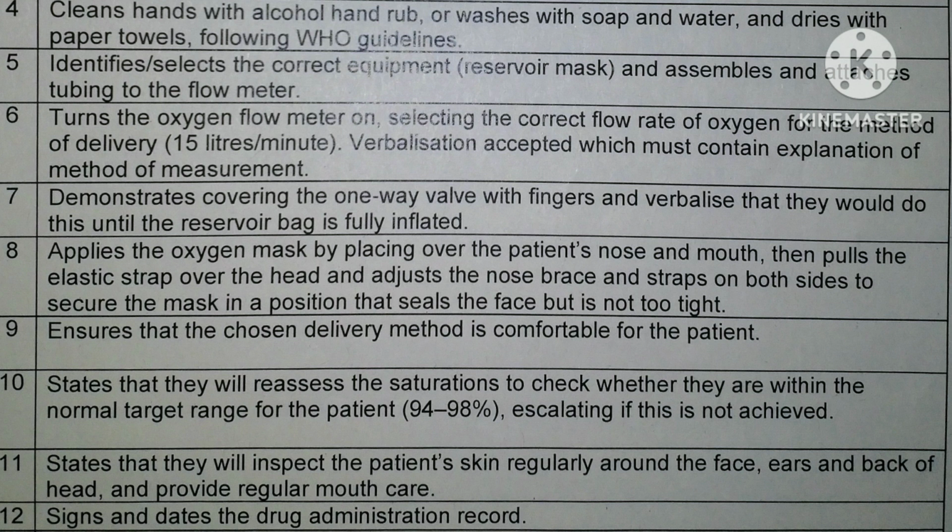Then we can tell them they can apply some moisturizer. Especially we should tell them, don't use Vaseline because petroleum jelly can cause burns when using oxygen. Any other moisturizing cream they can use to prevent dryness on the lips and nose. Then oral hygiene, we should tell them we will provide regular mouth care because it will be dry. Then we will assess the skin for any skin breakdown because of the ear strap they are using.